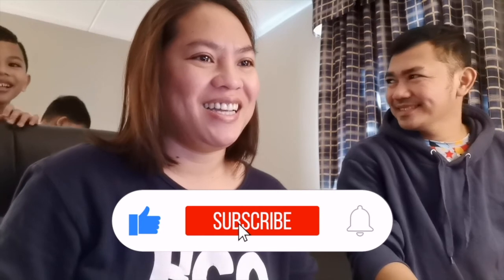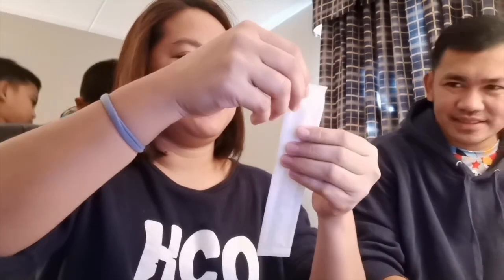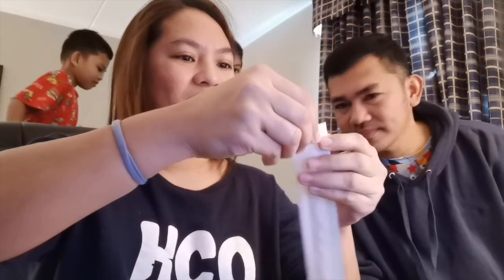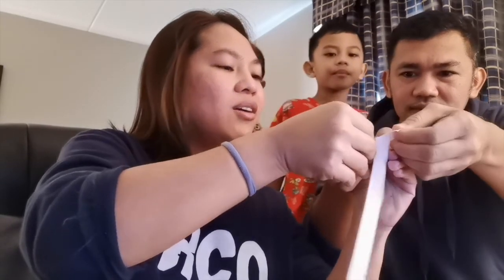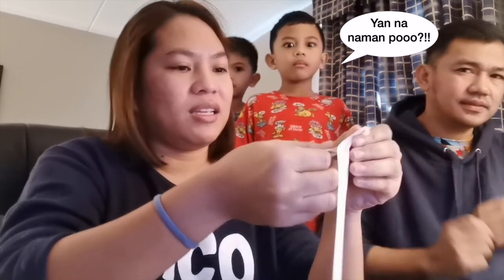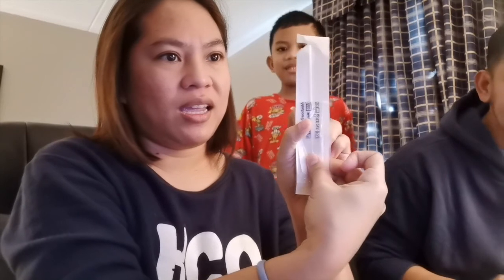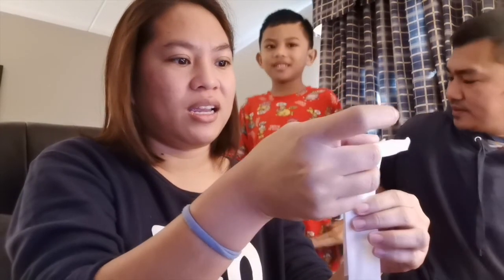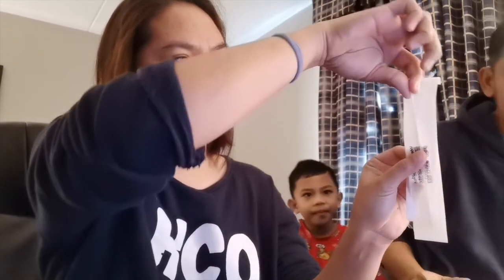The one that you have with you, you're gonna open it up. We're gonna open it. There's a little notch there. Halfway. So you're gonna open it, and there's a little notch in the middle that you're gonna hold. This one. So just pull it out.